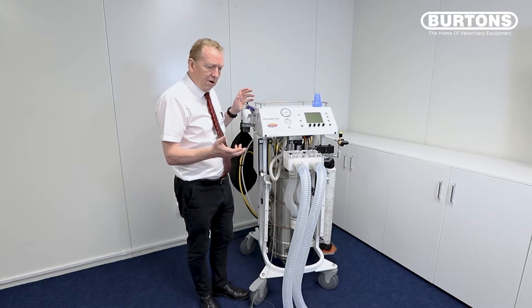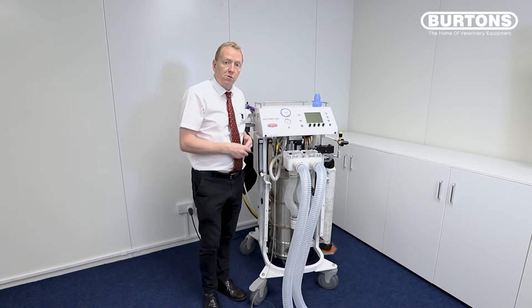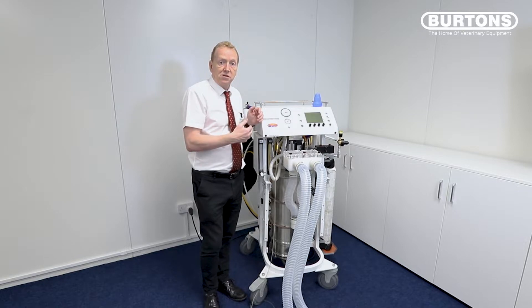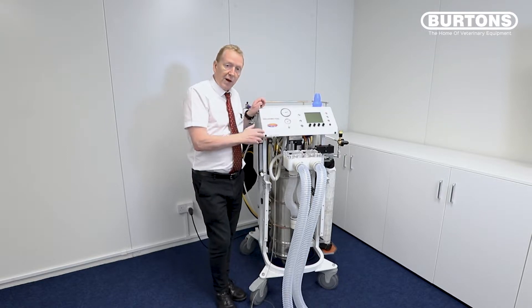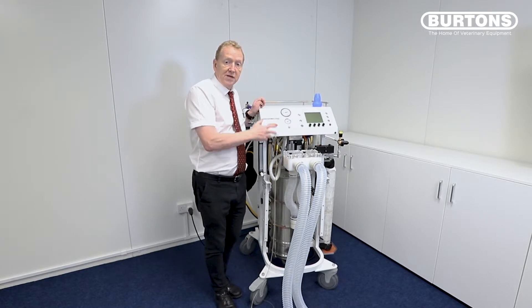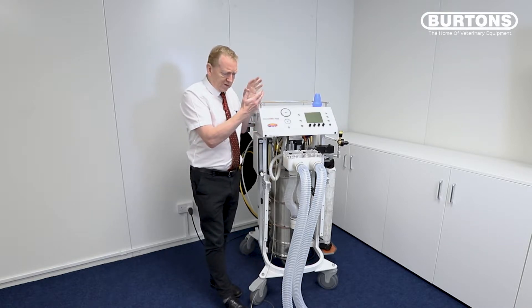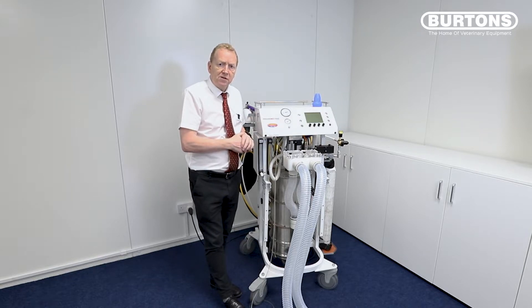Very simple to use — it requires two things: mains electricity for the operation of what we call the auxiliary system, and a piped oxygen supply for the anaesthetic circuit. Note that we don't need any oxygen to drive the bellows because there's no bellows. We're using a piston assembly, which is unique to the Tofonius, and that piston moves under the control of a motor, all part of the servo system.